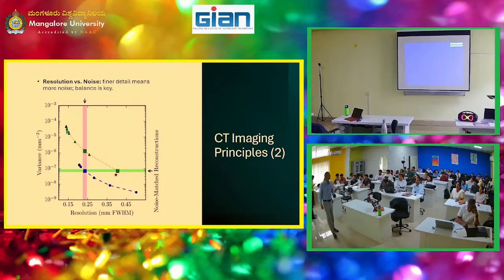Because just think, let's say you have a tumor in your bone, or you have a tumor in soft tissue. Which one would require more energy for disruption? The soft tissue or the bone? Yeah, the bone will require more energy, right? The soft tissue doesn't because it's very exposed, it's right there. So that's the purpose of the Hounsfield unit, to help guide you, calculate for each pixel, literally, all of the Hounsfield units are per pixel, how much energy is required for you to irradiate the mass, okay?